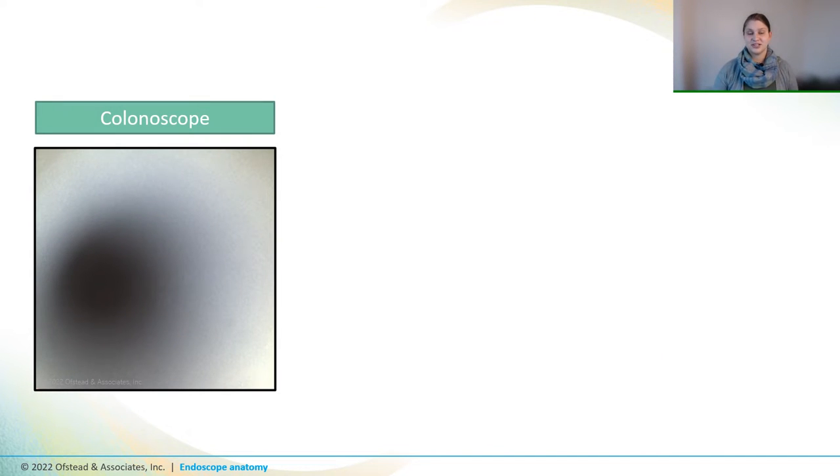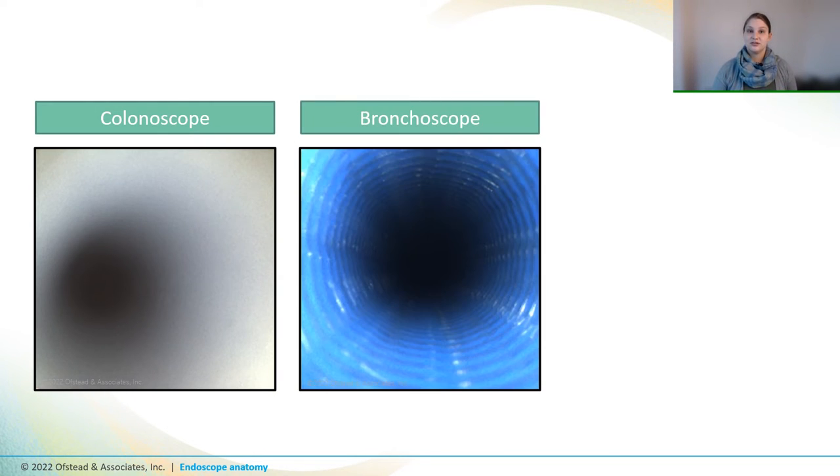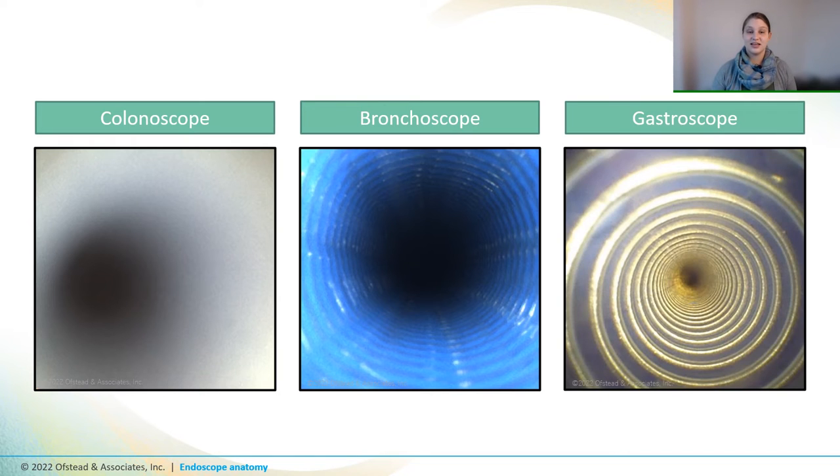Interior components can also look different depending on the type of scope. So let's compare the instrument channel of a colonoscope to a bronchoscope channel and a gastroscope channel. And you can see that they're super different. It's important to know what a new, intact, and clean channel looks like for each of the scopes that you have in your fleet so that you can identify when there's a problem.